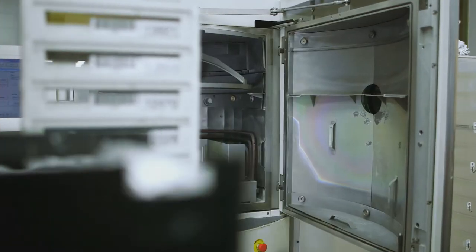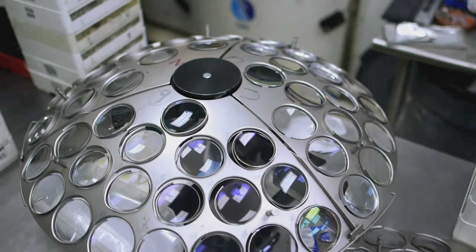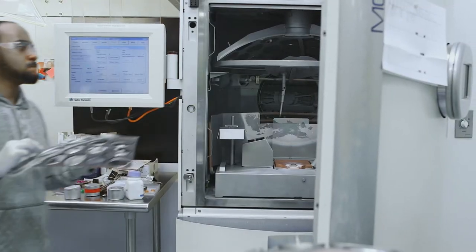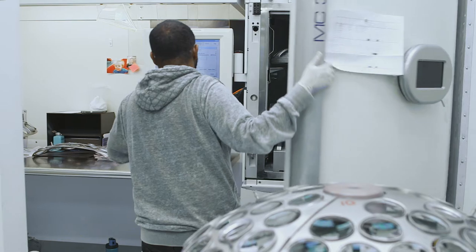After the TD2 coat has been applied, the lens moves to the AR coating machine. The vacuum chamber and electron beam gun combine a unique set of minerals to create the anti-glare coating. The two coating processes combine to protect against scratches, block UV light, and in some cases blue light. The AR coating also reduces glare, repels water, and even repels dust.